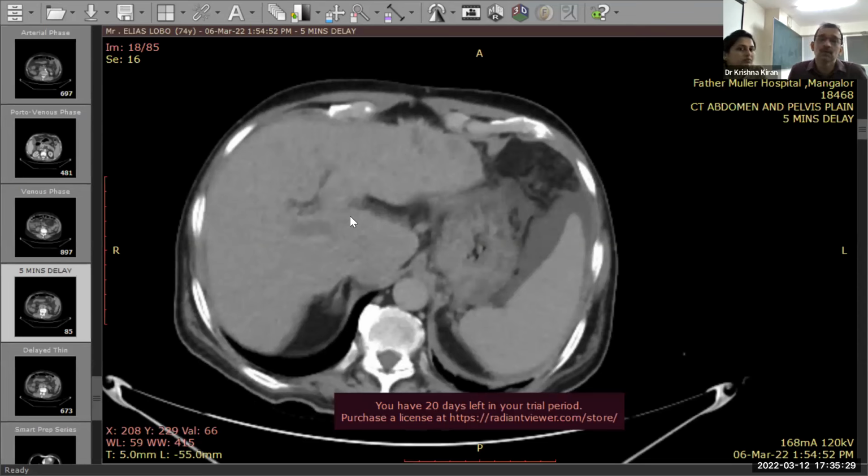the main identification of infiltrative HCC is through the tumor thrombosis of the portal vein. On thrombosis of the portal vein, the perfusion of the organ changes. Hence, the classical characteristic enhancing pattern of HCC will not be present in the infiltrative type of HCC. Also remember that the portal vein thrombus completely changes the dynamics of the liver and also the enhancement pattern. And second, when the HCC becomes large, it loses its early arterial phase features; it doesn't follow those rules. Particularly large HCC. As I said, it's probably a diffuse type HCC where multiple nodules are there. So that is the most likely explanation.